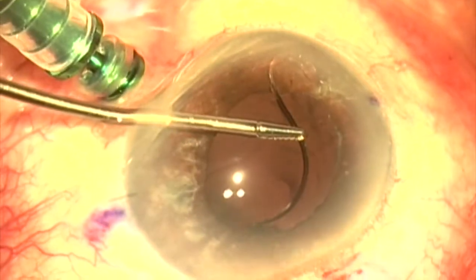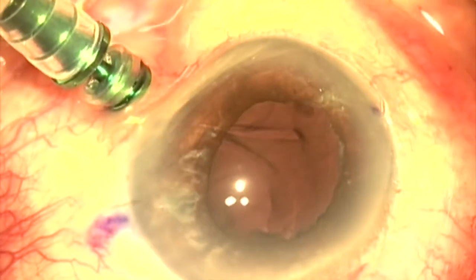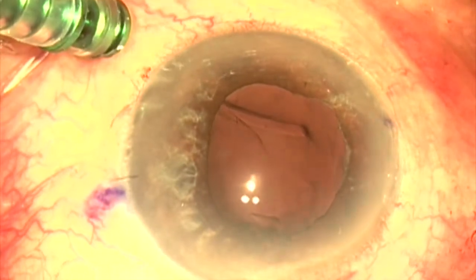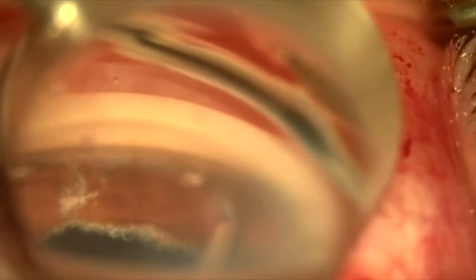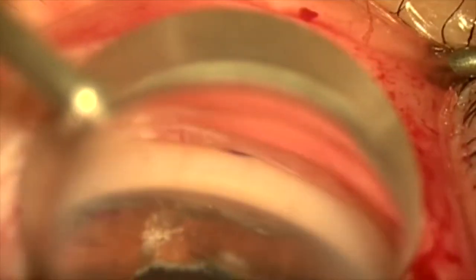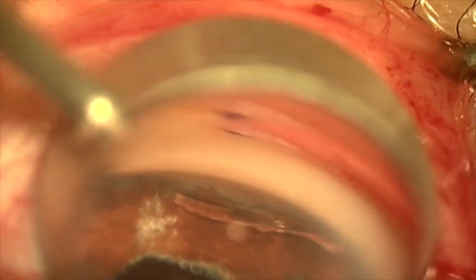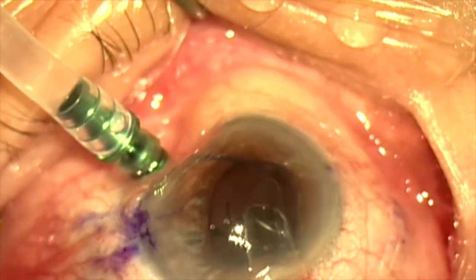The other portion of the haptic is cocooned within the tunnel of fibrosis. We're going to come from the side using a gonio lens, much like we would do for a MIGS procedure, and grab the other side of the haptic and pull the cut end through the tunnel of fibrosis without any bleeding — and this comes out very easily. If I had just pulled on this haptic, there would have been significant bleeding and possibly iridodialysis. We can now pull this haptic remnant out through the main incision.